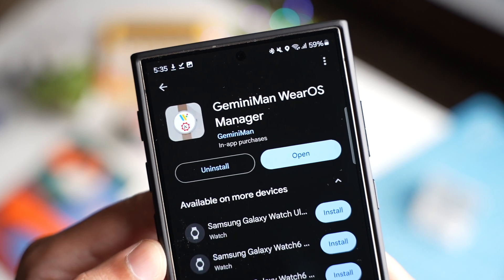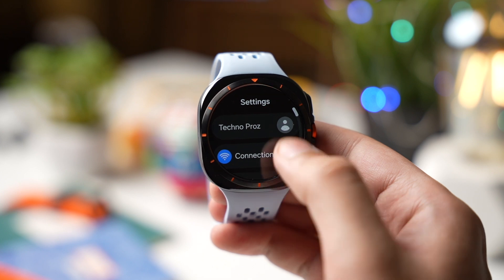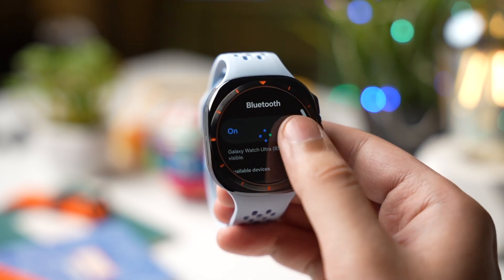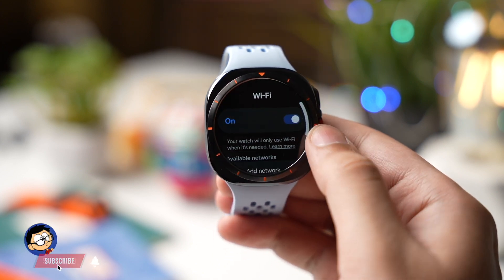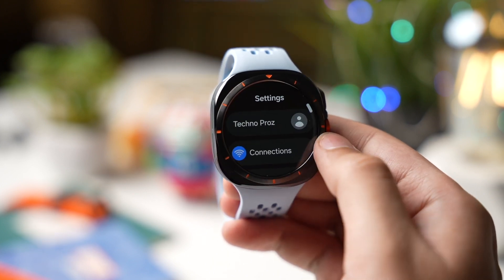After that we have to make some changes on our Galaxy Watch. First go to Settings, tap on Connections, and turn off Bluetooth. Then turn on Wi-Fi and make sure it is connected to the same Wi-Fi network to which your phone is connected.